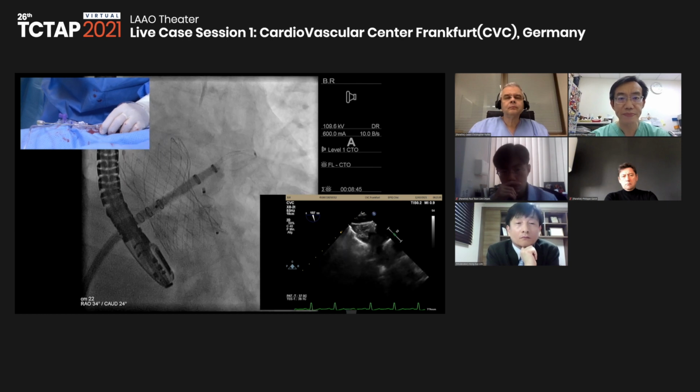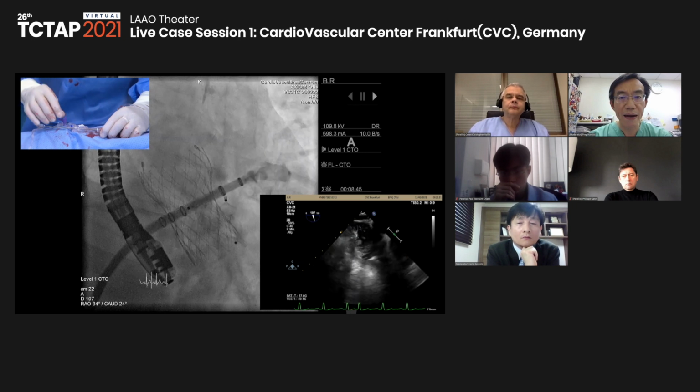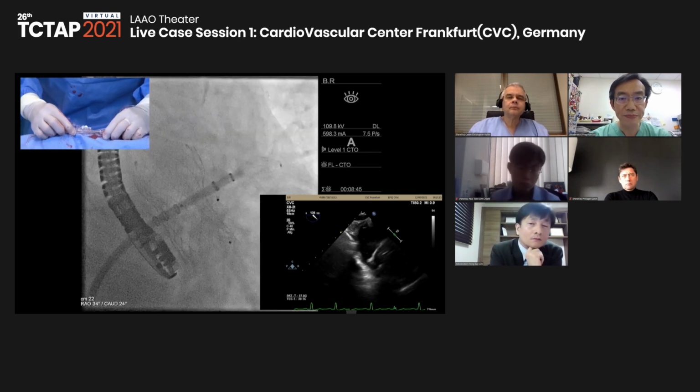Let's do another cine here to confirm that. Okay. So now I will slowly deploy it. I will do this as slowly as possible.